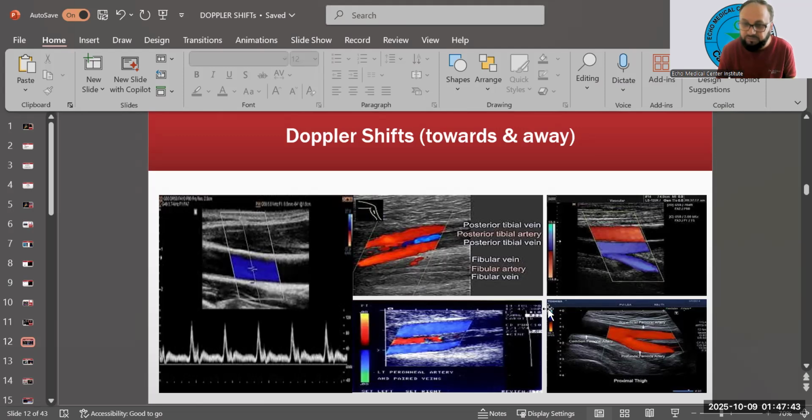So the color bar was inverted. It says whatever is blue, make it red, because that's the positive Doppler shift area. This part is for the positive Doppler shift. It doesn't matter what it is below in the picture, but that has to be red in the picture if you invert the color. Look at here. Here, this area is red. We want the Doppler shift to be positive for this artery, and that's positive now.